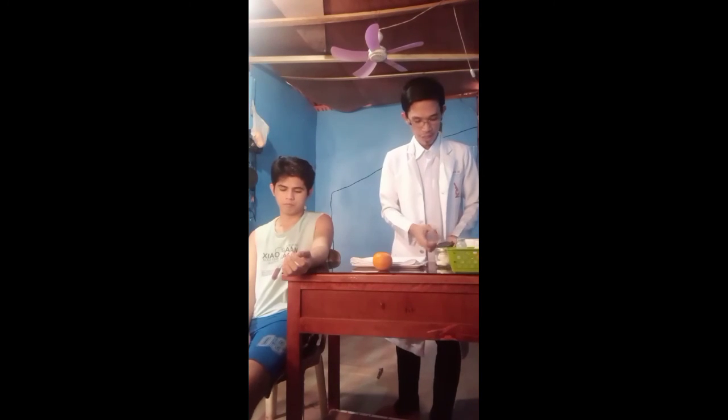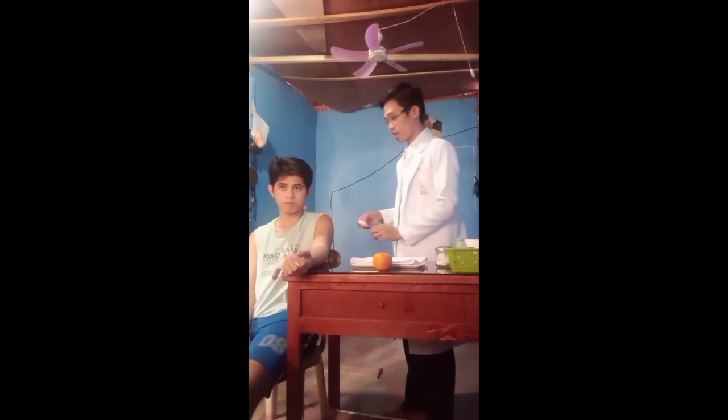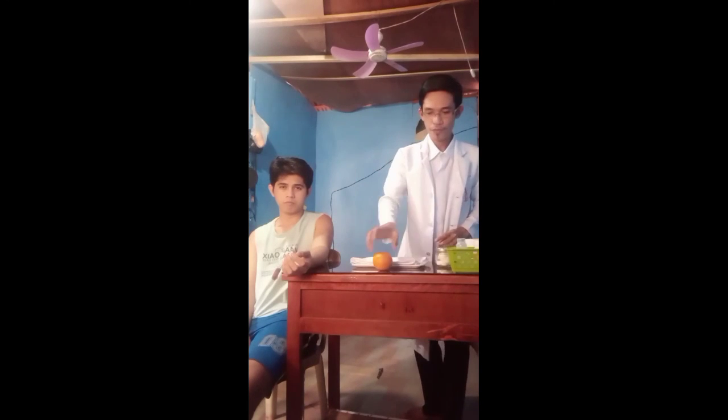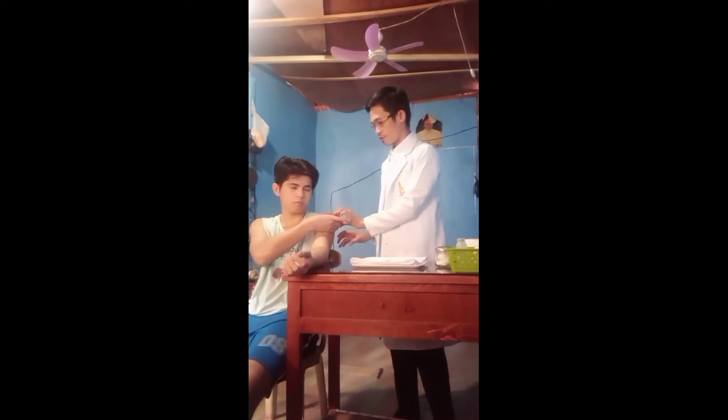In injecting, you need to clean first the site that you are going to inject for your patient. This reduces pain at the moment of injection and reduces discomfort from needle movement. Next, pull back the plunger.